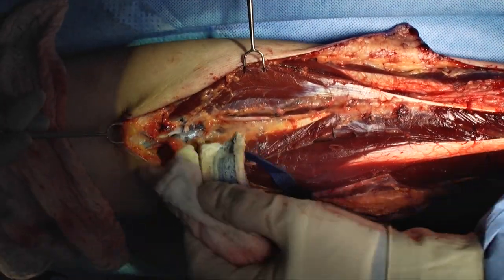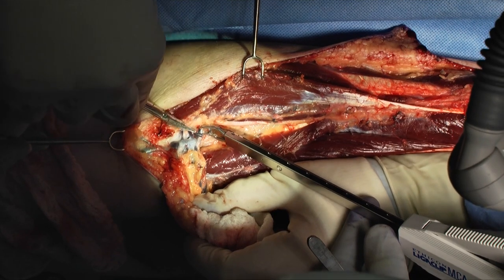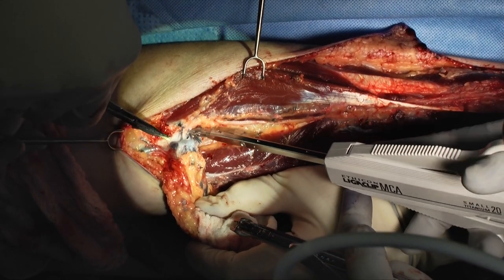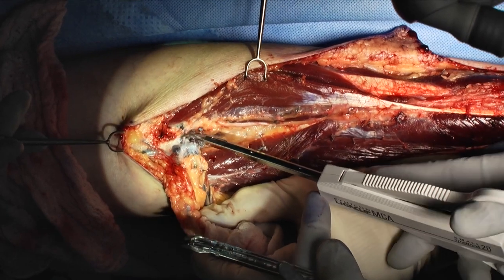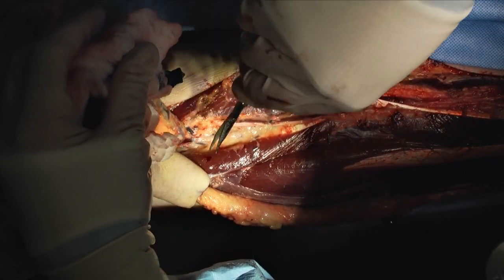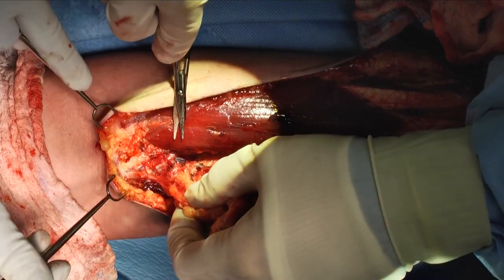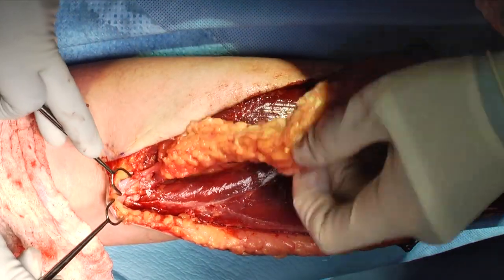Here we can see the deep venous structures in the proximal forearm around the takeoff of the radial artery. This generally tends to be an arcade of veins that is relatively difficult to dissect, so some time and patience is required to make sure the veins are ligated properly and safely to avoid bleeding after the tourniquet is let down or after the flap has been reanastomosed. In this region, you will generally see the venae comitans, which follow the radial artery, join up with the superficial circulation in the cephalic vein.